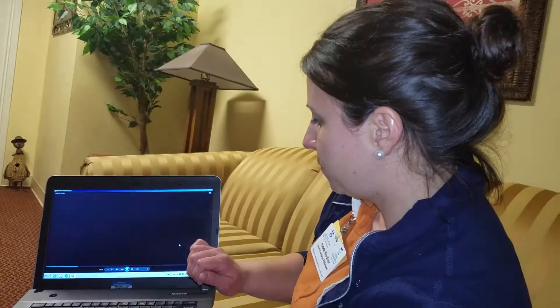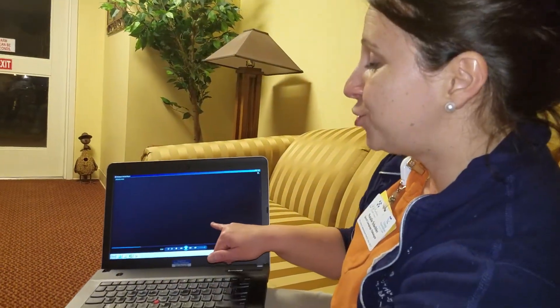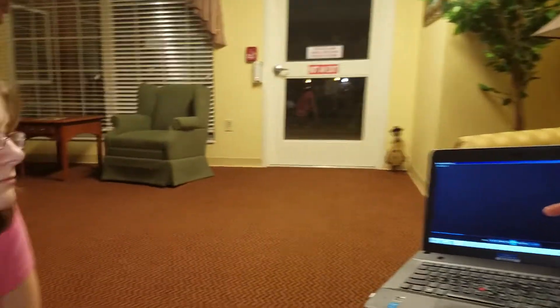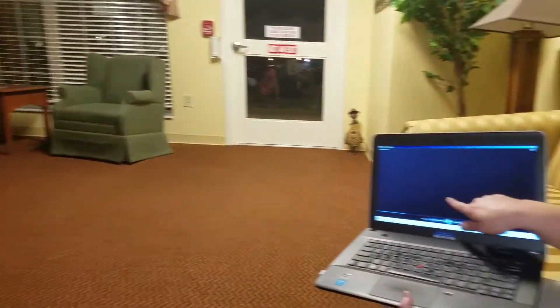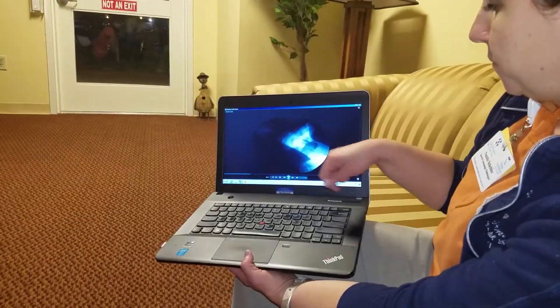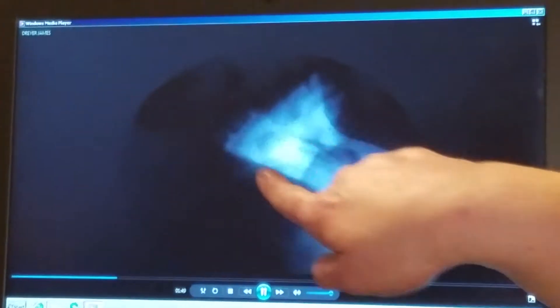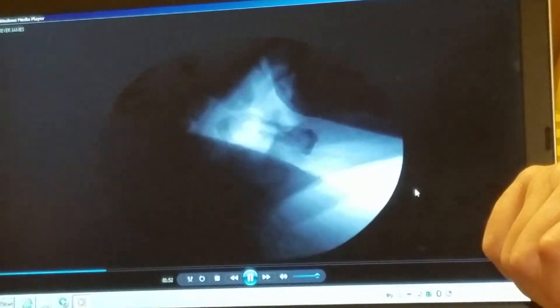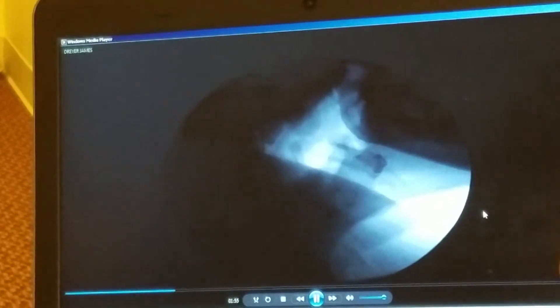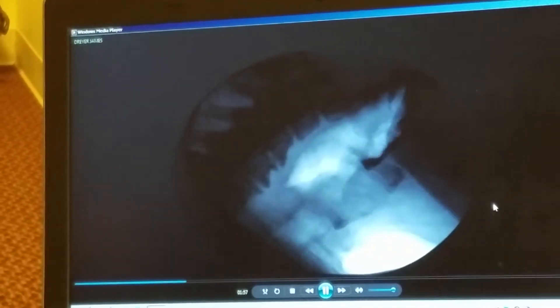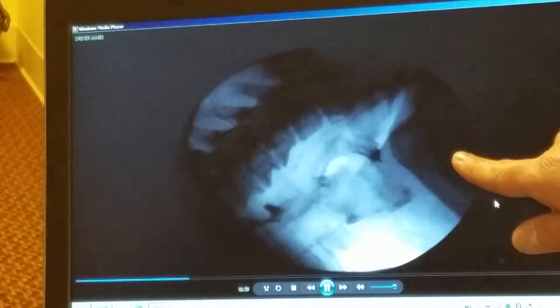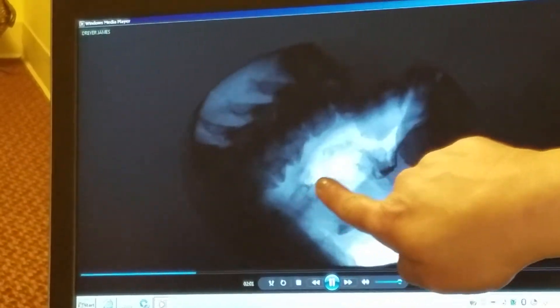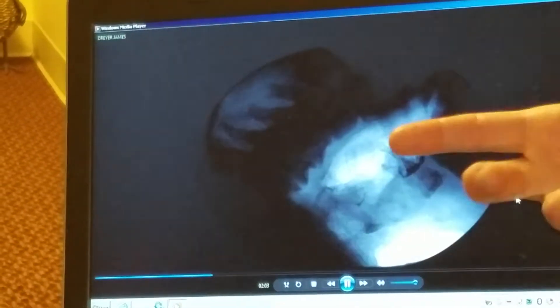It was timely, he had really good timing on his swallow. Then we tried nectar thick, what he's been on for a while, and you'll see the difference there. There's the shoulder, that's when he was trying to feed himself and his shoulder was getting in the way.